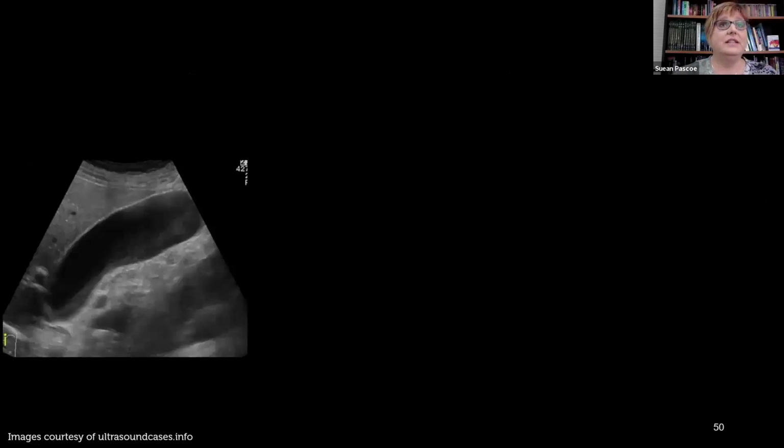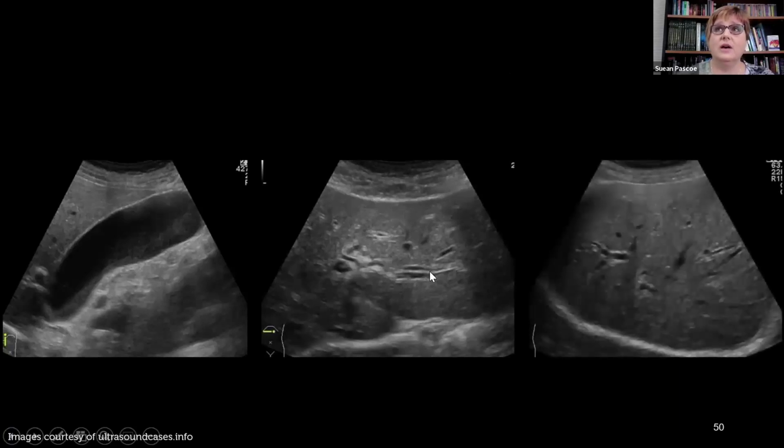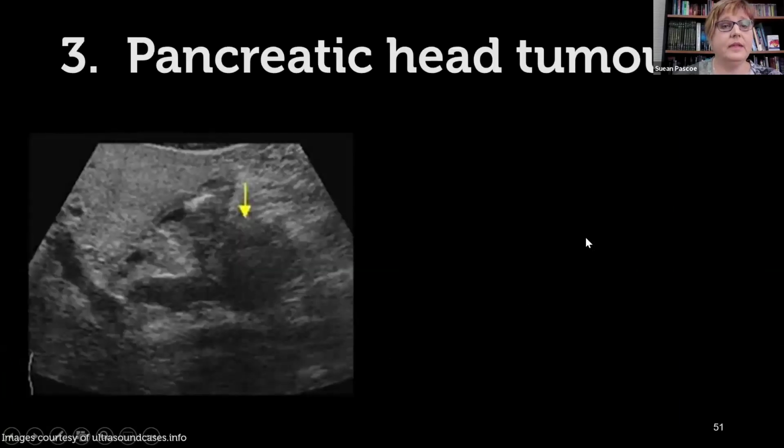And for this patient, they had a very swollen, enlarged, dilated gallbladder, and you can see some sort of echogenic content in there because that bile's been a bit stagnant because it's obstructed. And we have, again, the double barrel shotgun sign in the intrahepatic portion of the bile ducts in the right-hand side of the liver. You can just see those bile ducts are really dilated again.